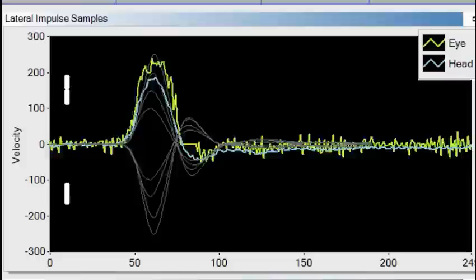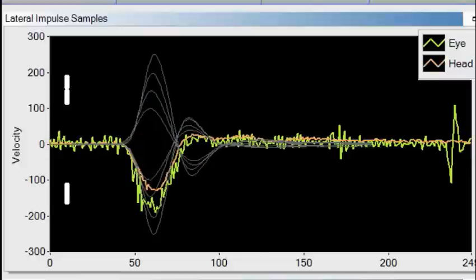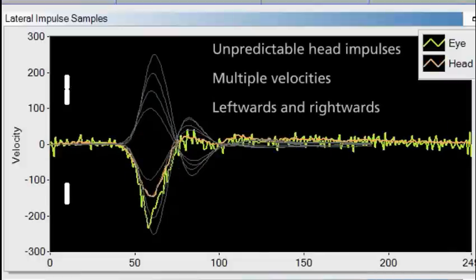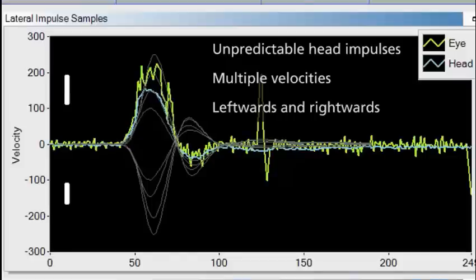The collection algorithm assures that only good head impulses are accepted for analysis. When performing the head impulse, you want to make sure it is randomized. Perform multiple velocities in randomized left and rightward movements.